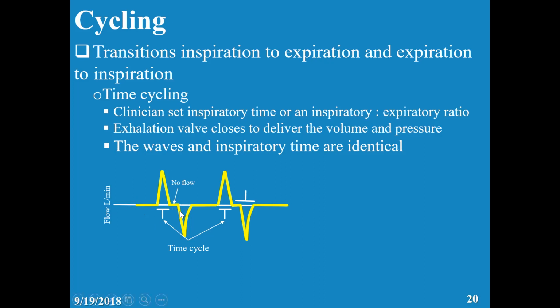So you play with the inspiratory time and the expiratory time, or the ratio between inspiratory and expiratory, and the rate, until you see this. Not long, but not zero. And that means the hold between inspiration and expiration is comfortable for the patient. Is that clear?